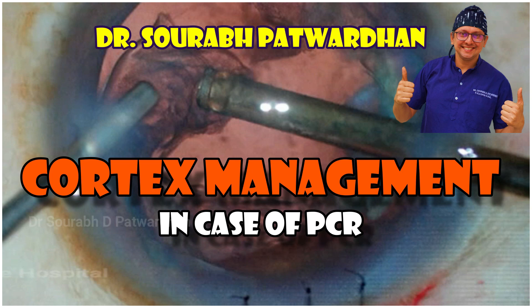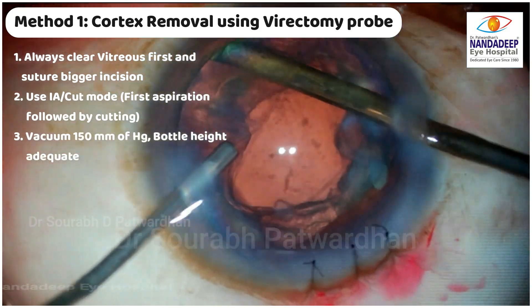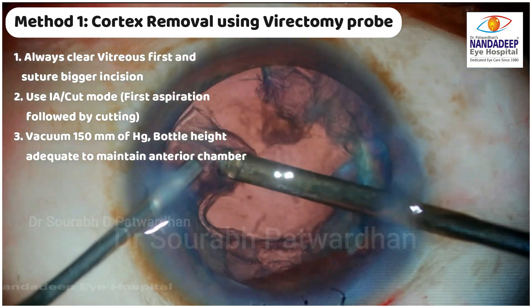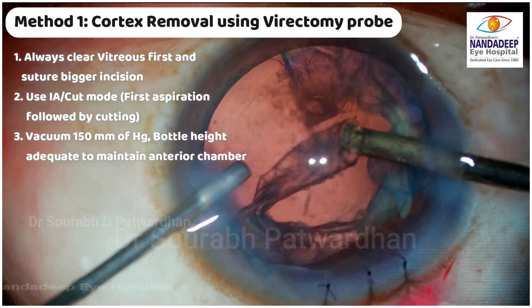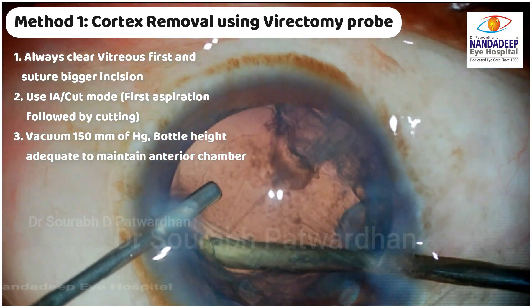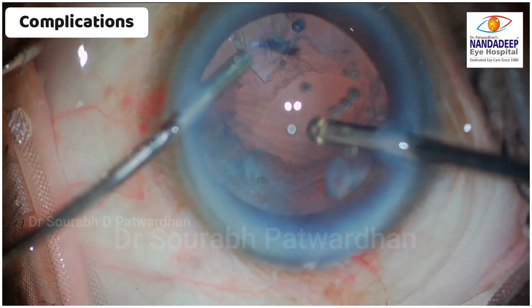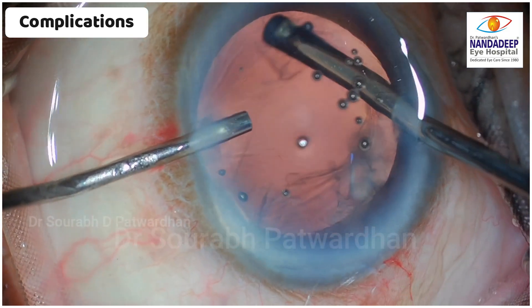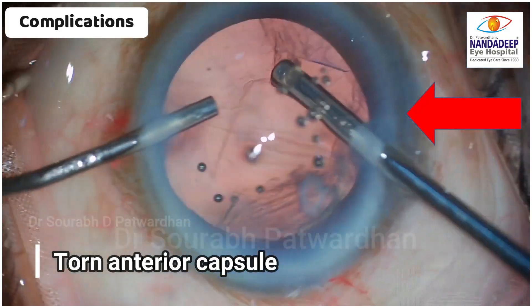Now how to remove the cortex? Once the nucleus pieces are out, you have to remove the cortex. We usually use the same vitrectomy probe. Make sure the vitreous is cleared first, then toggle between IA-cut and cut-IA mode. When removing the cortex, use IA-cut mode where aspiration starts first and then the cutting starts — good foot switch control is needed. One important caution: the vitrectomy probe has sharp edges, so if you touch the anterior capsule rim it may tear it, and if you hold the anterior capsule with the probe it may cause dialysis.